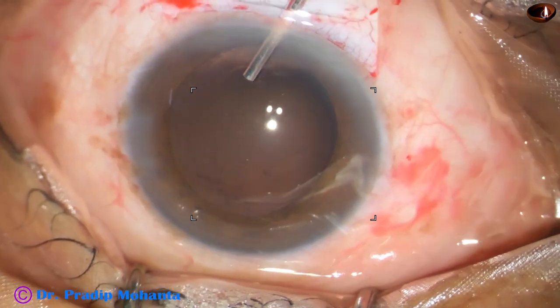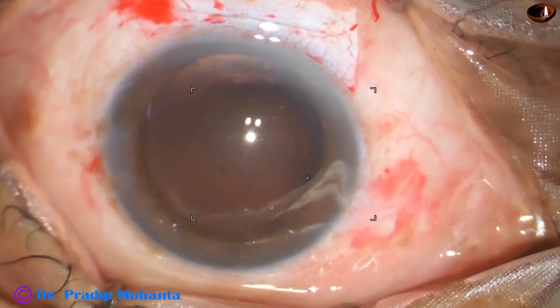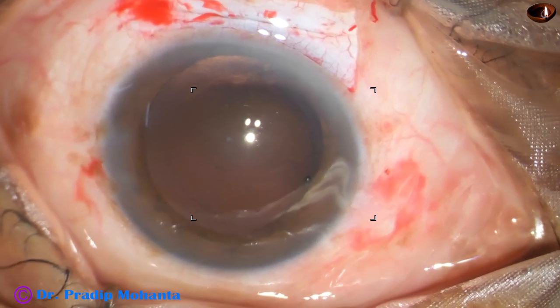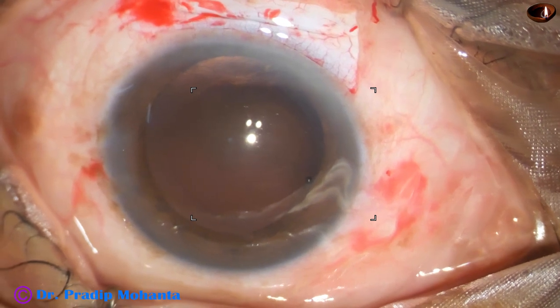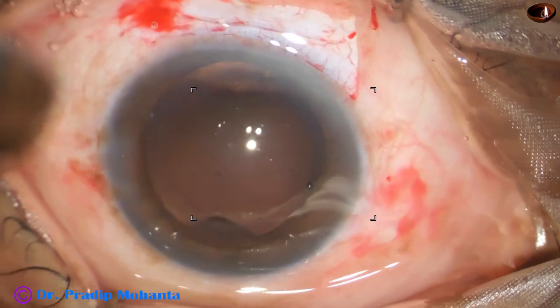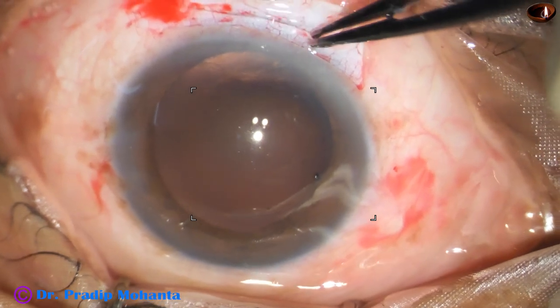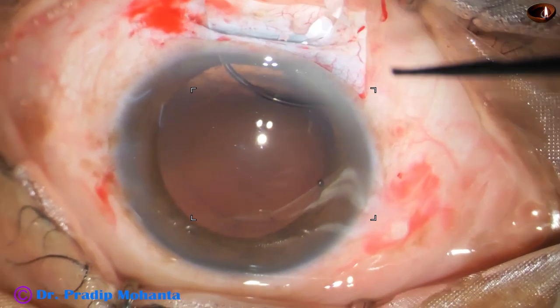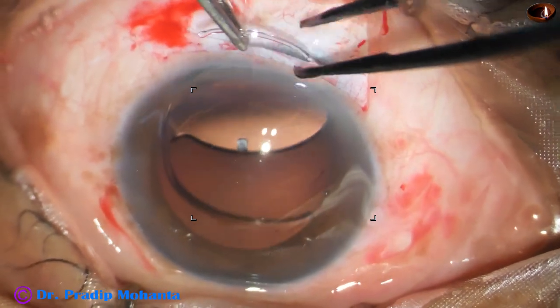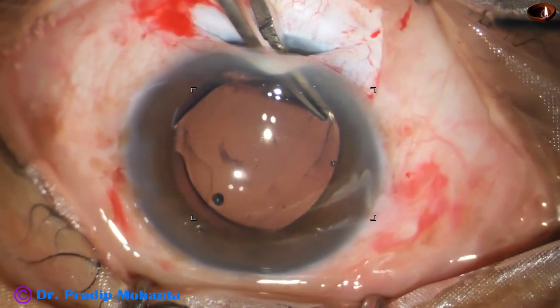Now it is time to implant the intraocular lens. The lens being placed is a PMMA lens from Appa Sami Associates — its brand name is Liberty lens. The surgeon has no financial interest but is grateful to this ophthalmic company. The PMMA lens is inserted: once the leading haptic goes into the capsular bag, the trailing haptic is placed in the bag.